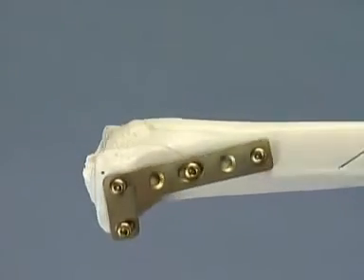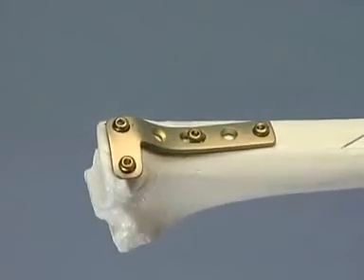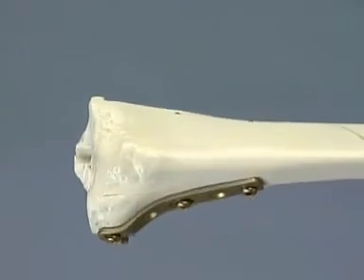The fixation is now stable, and the plate offers the required support. The buttressing has been achieved by the distal screws.